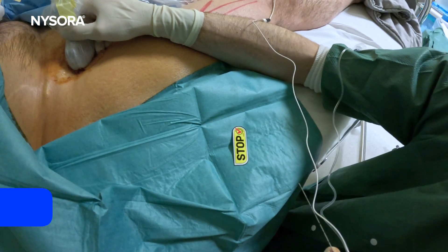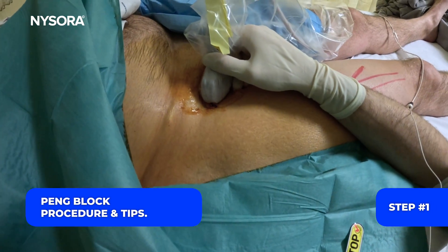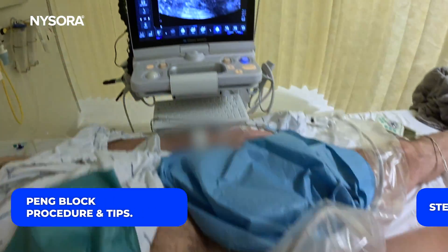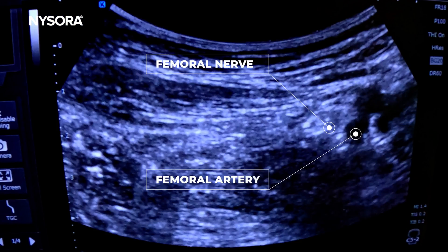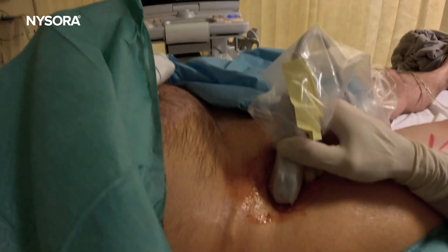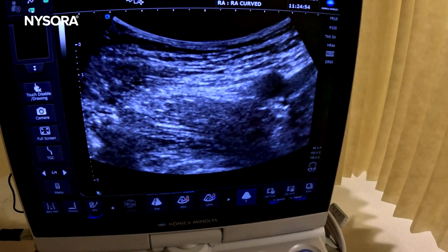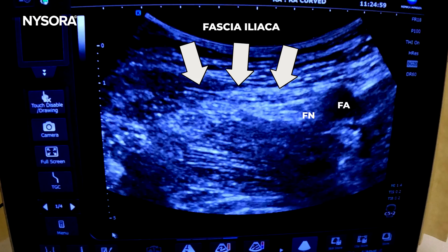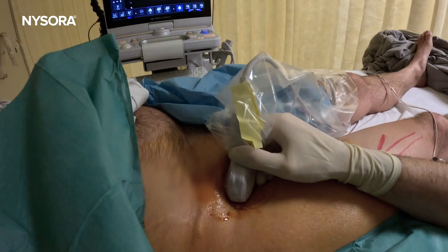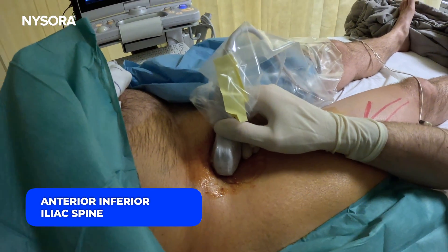We're going to do the PENG block or hip block, and we're going to start scanning from the view of the femoral artery and the femoral nerve. Going slightly more proximal — here we see the femoral artery, femoral nerve, and the fascia iliaca. Now we're going to scan proximal until we start seeing the anterior inferior iliac spine as step number two.